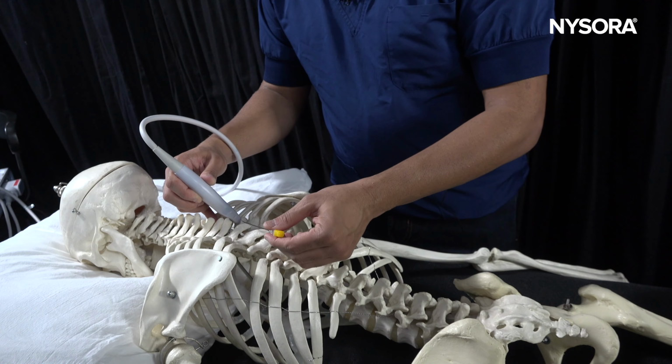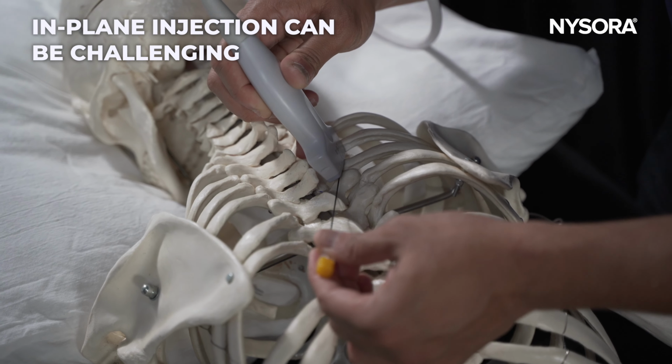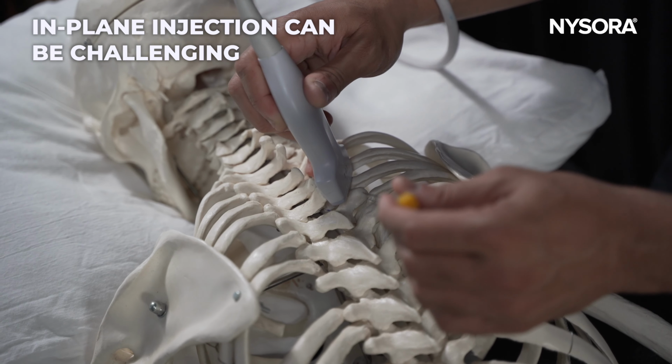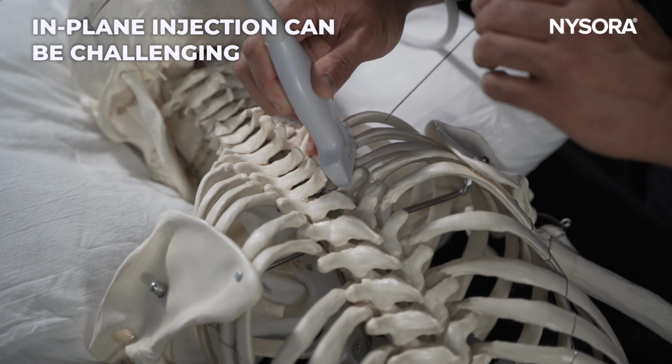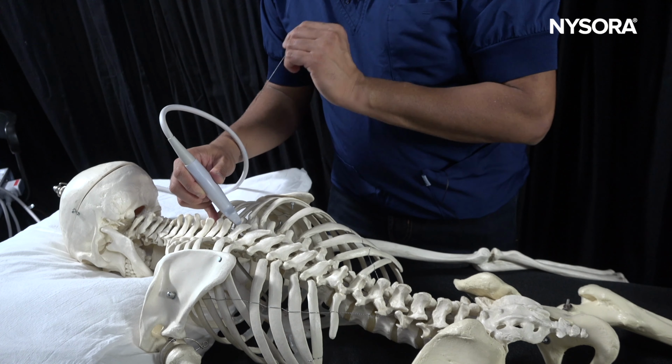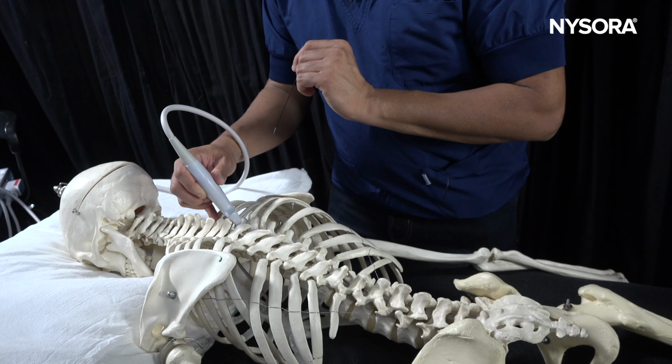You can also perform the injection in plane, but given the angulation, it can be trickier getting into the joint using an in-plane technique. So my technique of preference would be the out-of-plane technique, going into the joint and injecting local anesthetic and steroid. Thank you.